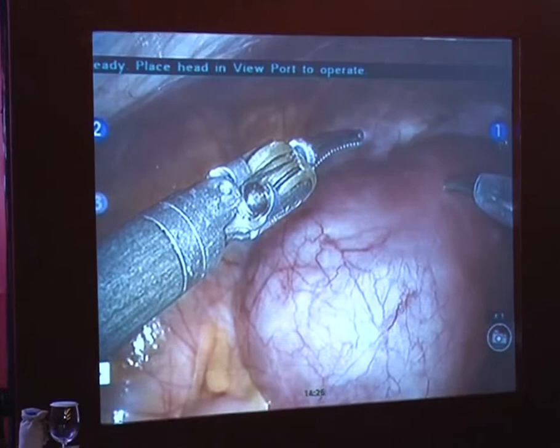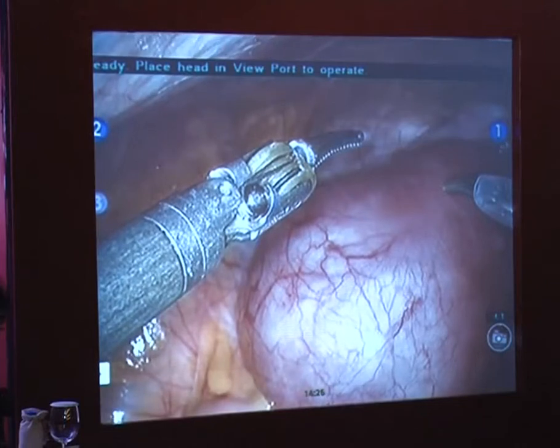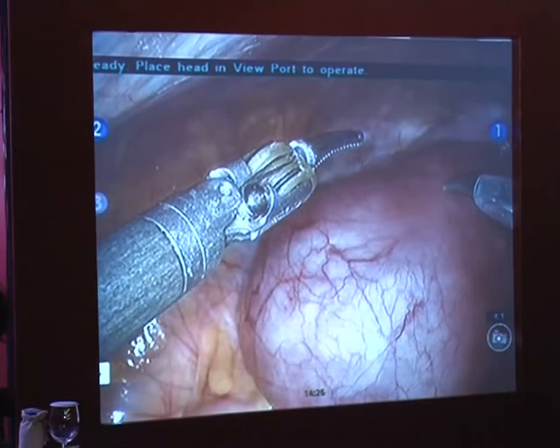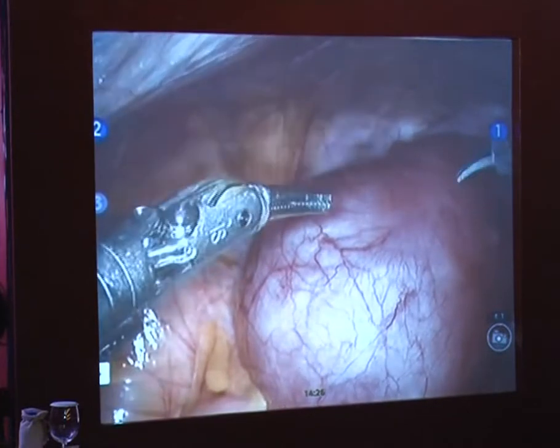That's it. I need to tilt the uterus. The uterus needs to be rotated. Can you rotate the uterus for me? Just like that. Yeah, there you go. I need it rotated up because I think we have a short spinal needle for one thing, so I need you to keep the uterus up like this for a second until we get it with some vasopressin.